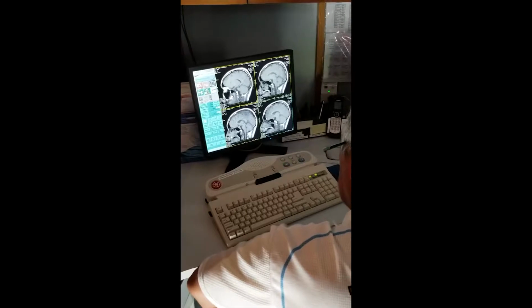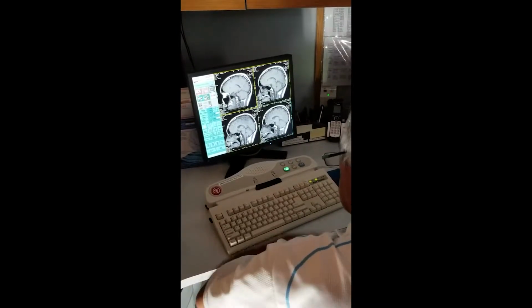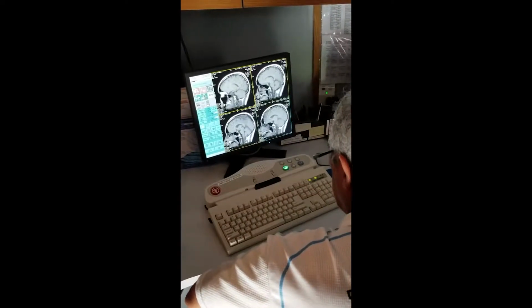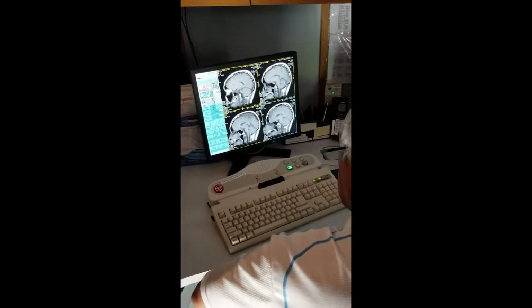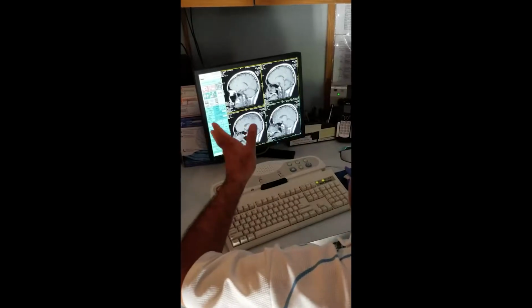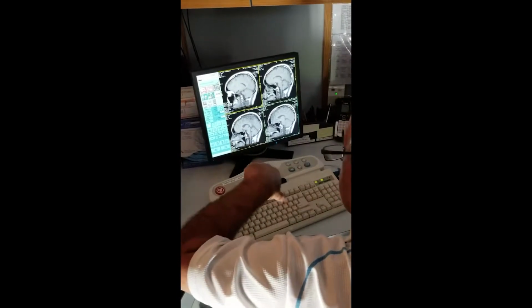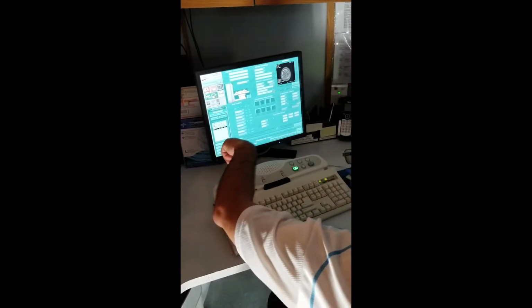So you already had everything. Fourth ventricle, pituitary, pons, aqueduct, corpus callosum, all of that, right? This is the tonsil, right? So everything looks good? Okay. Now I want to see the axial. I know axial was after this, but you know what? I forgot. Oh yeah, axial was sequence number 3.